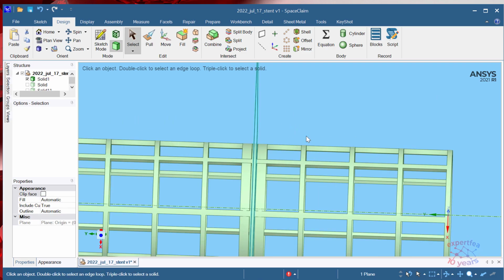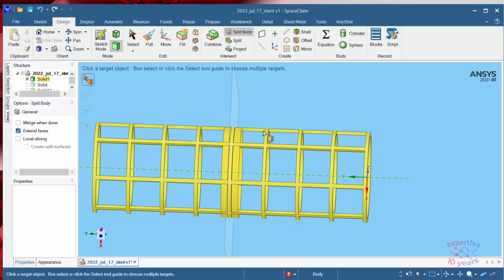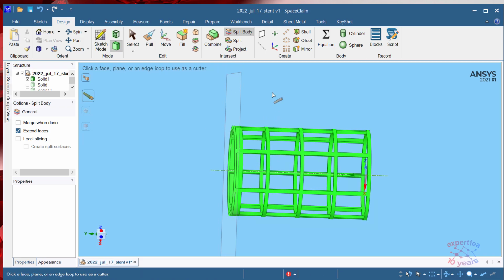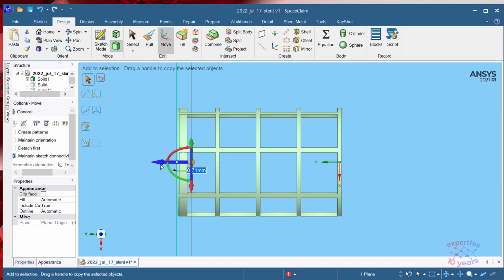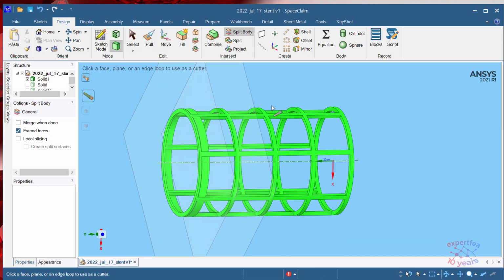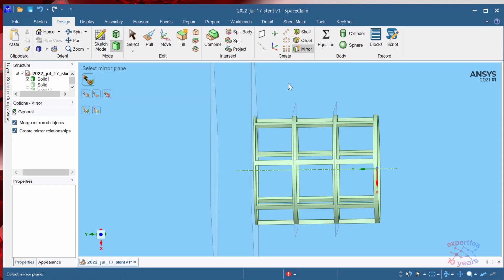So I created the midplane of the stent. Now I can firstly split this body, and I would like furthermore for this plane to move it, to copy it, yes, with Ctrl pressed. I will copy it here with 2 mm. Then I will split again this stent with this plane. I will delete this part. I will mirror what we have here.